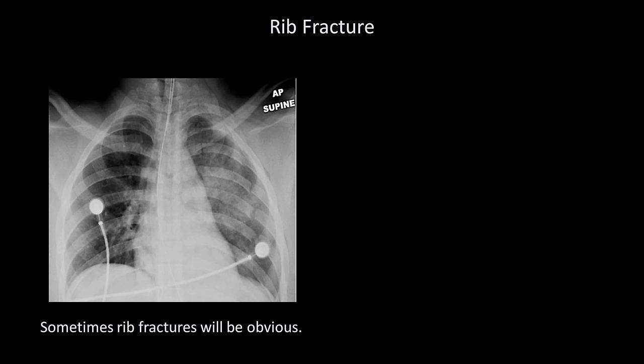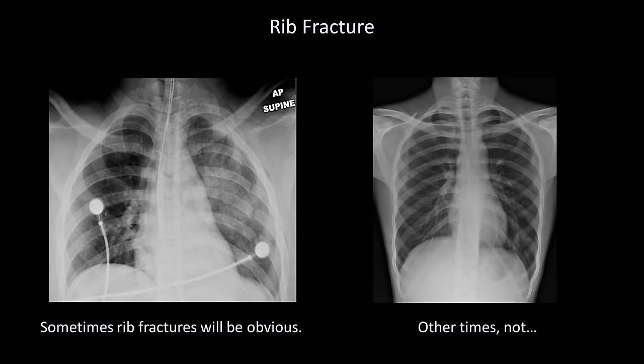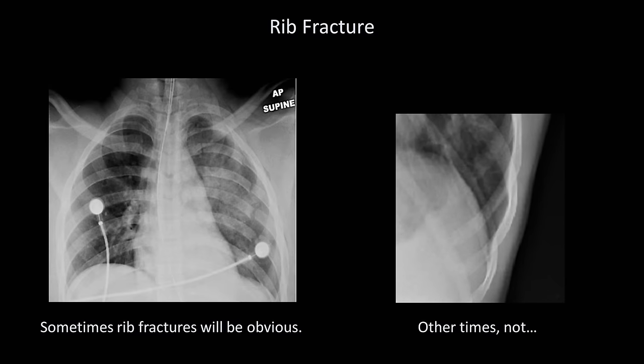First, rib fractures. Sometimes they will be very obvious — in this case the patient has numerous fractures of his posterior left ribs, almost certainly from high-impact blunt force trauma. Other times a rib fracture may not be obvious at all; this next example is probably invisible unless we zoom way in. Unless given a history of left-sided chest pain after a fall, a fracture this subtle would probably be missed on interpretation.